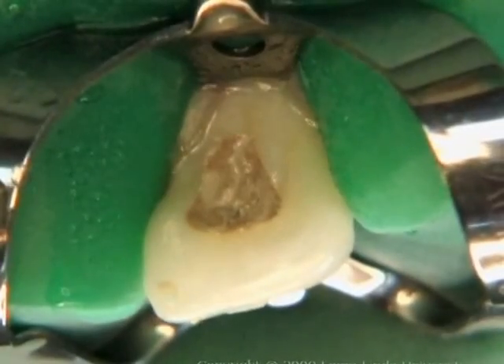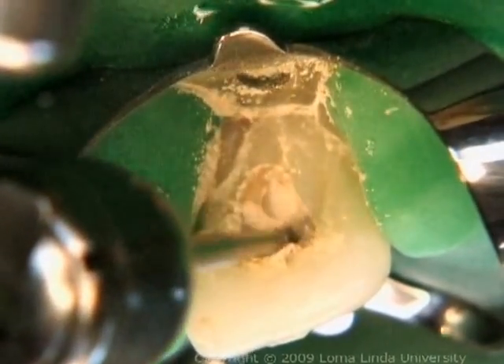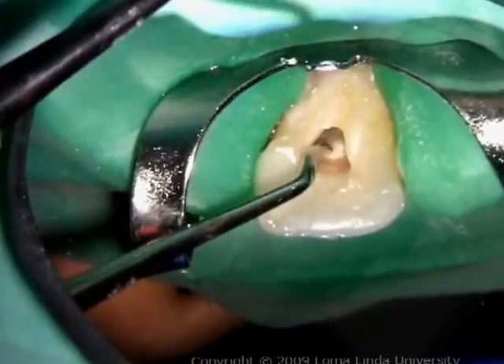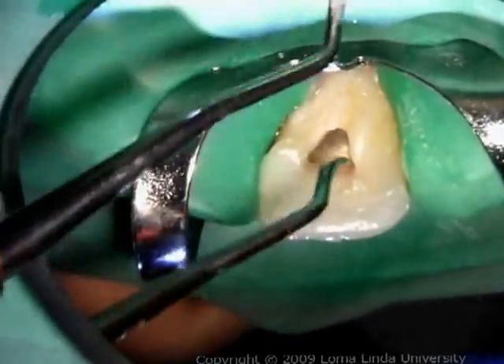The tooth is isolated with a rubber dam. The restorative material is removed from the access cavity. Refinement of access and removal of old obturating materials from the pulp chamber comprise the most important stage in the bleaching process.